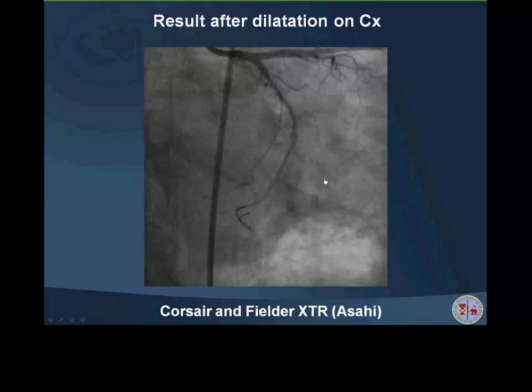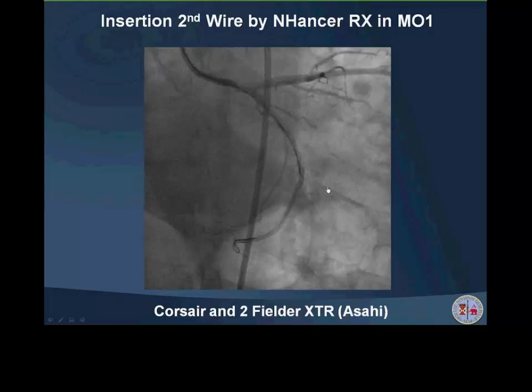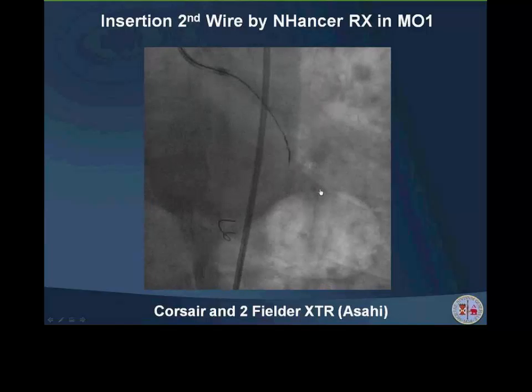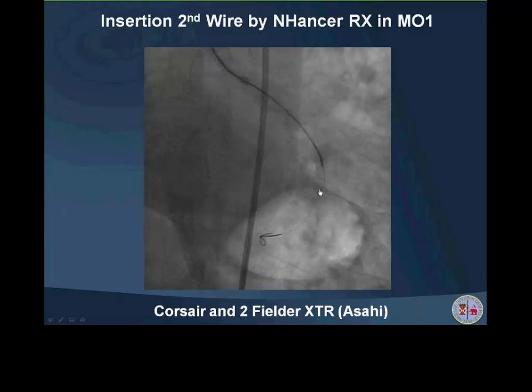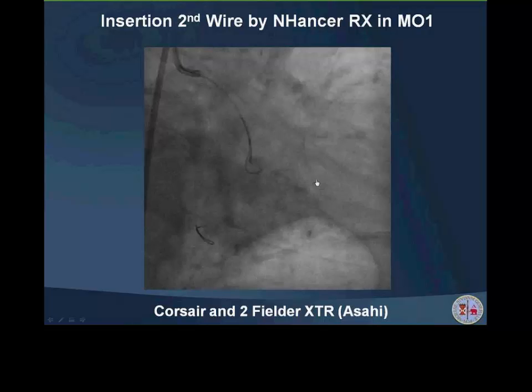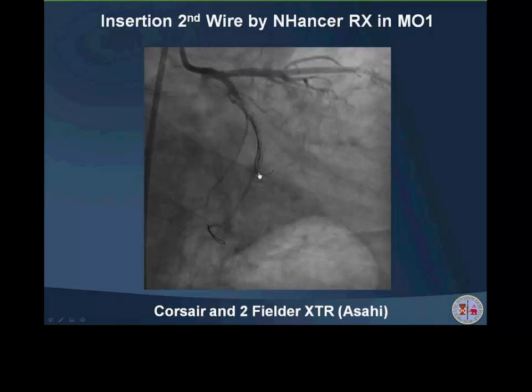And of course, the most interesting part is to recanalize the marginal branch. So in this situation, we were using, again, double lumen catheter, because we wanted to use the first preferential dissection plane and try to re-enter into this branch. And as you can see live here, it takes a little bit of time, but I think it's very important to understand how important it is in this situation to have the same microcatheter that can be used for both things, for using the dissection plane and to re-enter with another dissection and re-entry strategy.